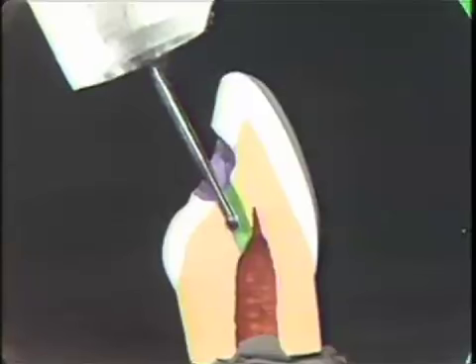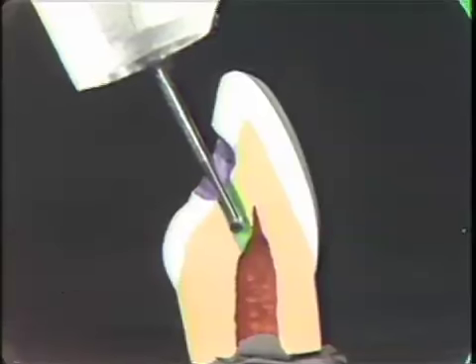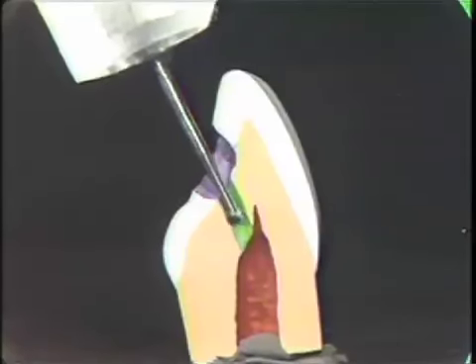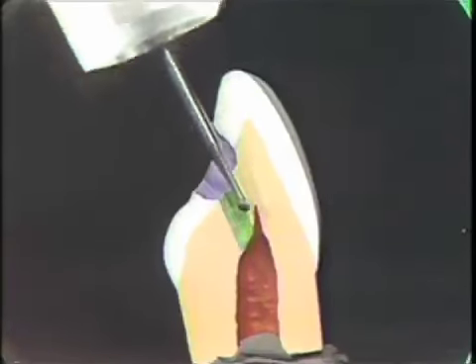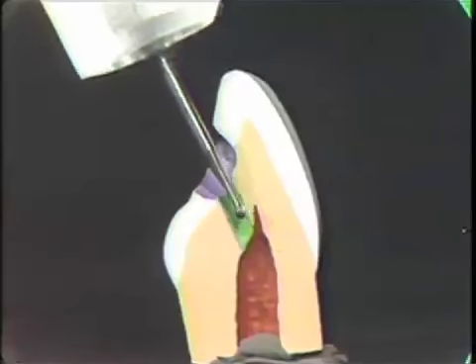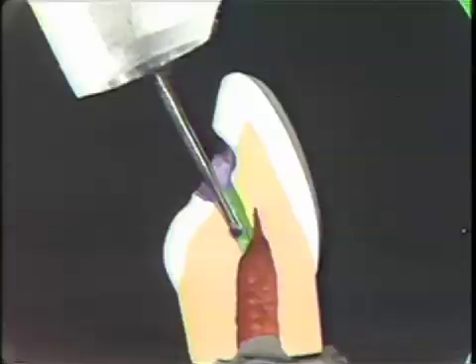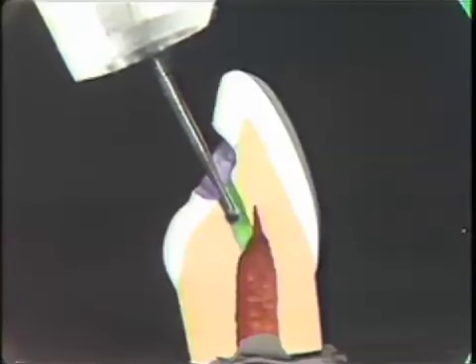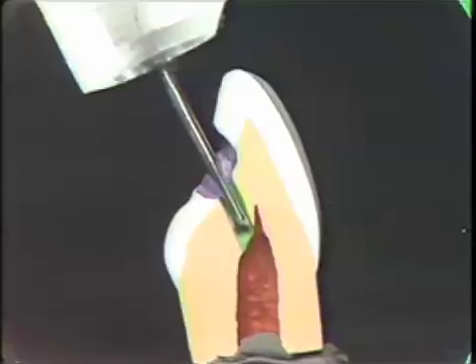The second way you might get into trouble is if you're in the proper angulation and you get part of the way to the pulp and you get kind of nervous and you feel like you've gone too far, so there's a tendency to start to drill around in this area looking for the pulp. Now, you never want to do this, because if you find the pulp, it'll just be by accident. The only way to find the pulp is to really know where it is and go directly to it.